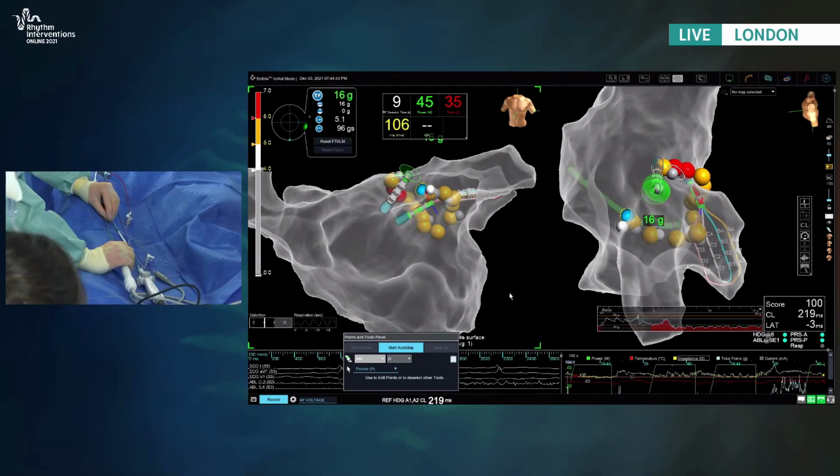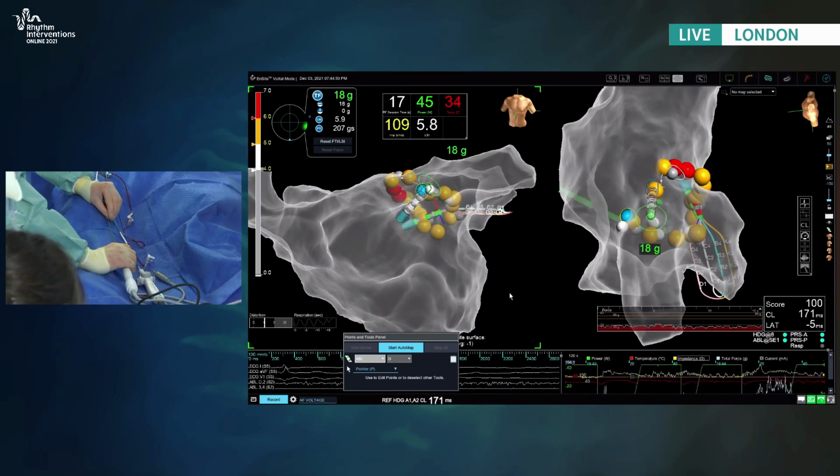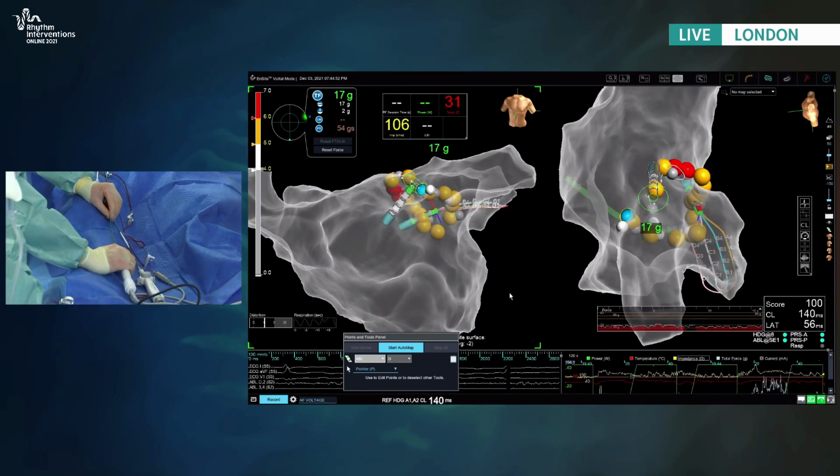While we were doing CT anyways for merge procedures, we kind of got two birds with one stone. So we used that to exclude thrombus in the appendage with a specific late-phase protocol, where you can really, even in low flow LAAs, exclude thrombus. There's a very high negative predictive value for that.